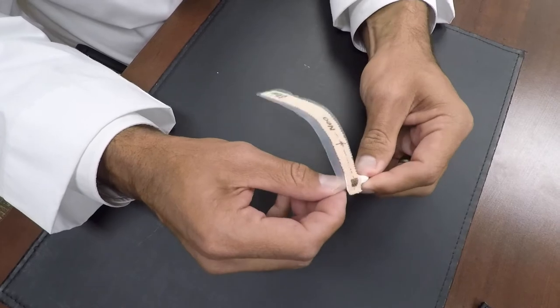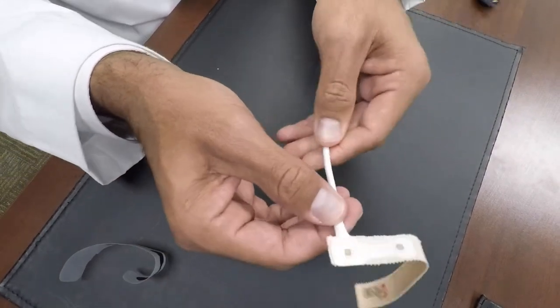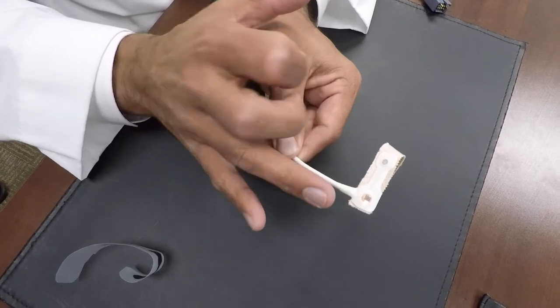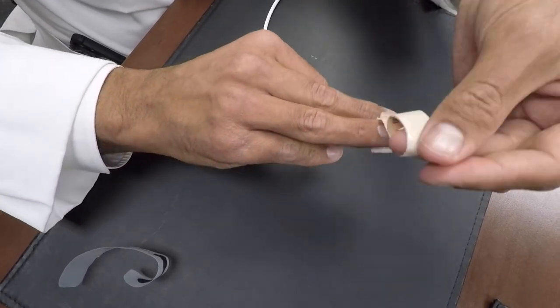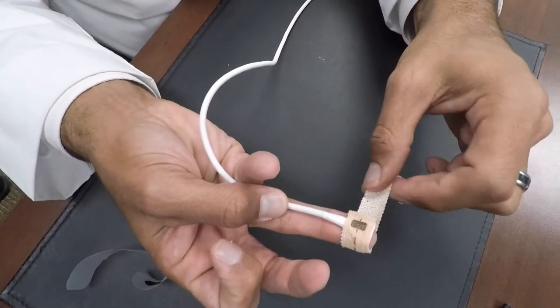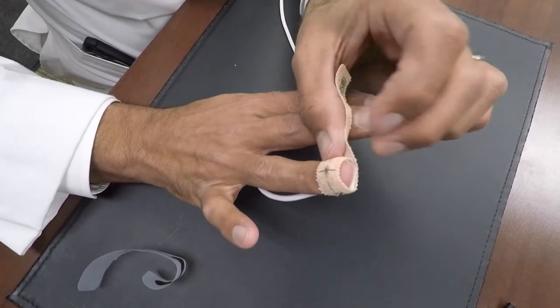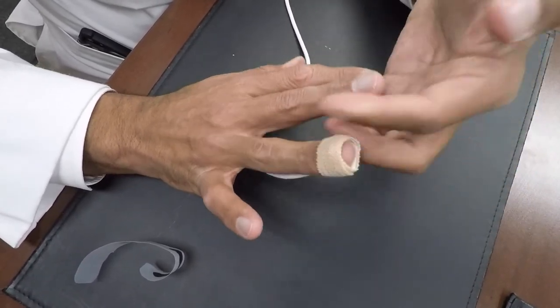For the cloth sensor, you want to take this component off. A little different on this one is that the sensor is actually right here attached to the wire — the beam and the sensor is over here. You take the pad of your finger, put it right over that, and wrap it around again on the ring finger or the middle finger. You want to tighten it just enough so that the black square and the sensor and the beam line up perpendicularly through the finger. The black pad is there and the star is there, so they're lined up pretty well. You can then wrap that around.